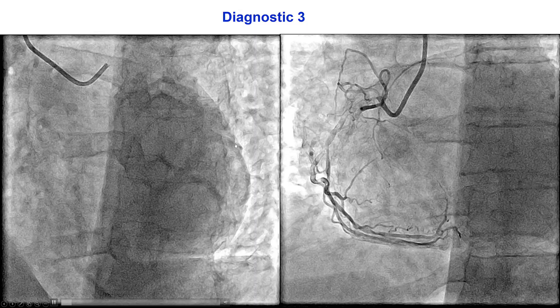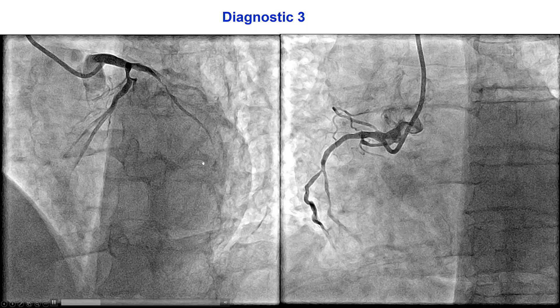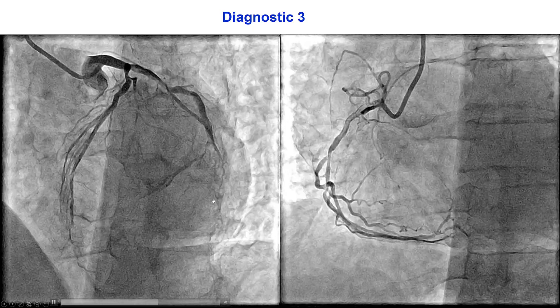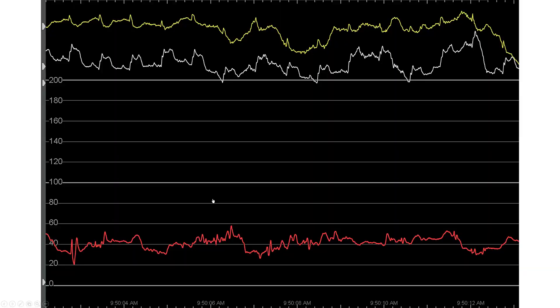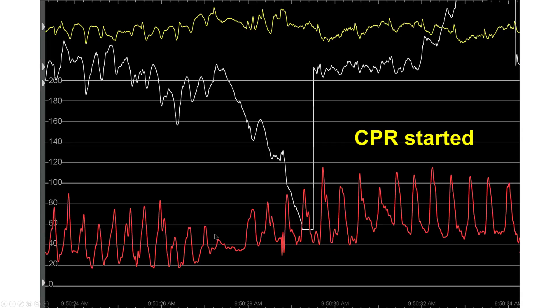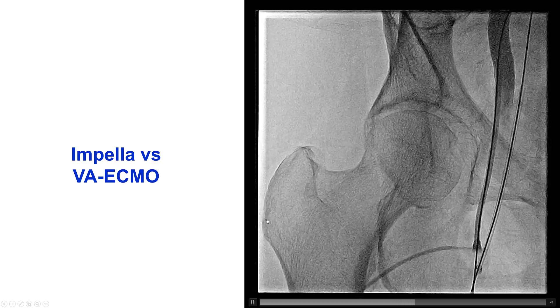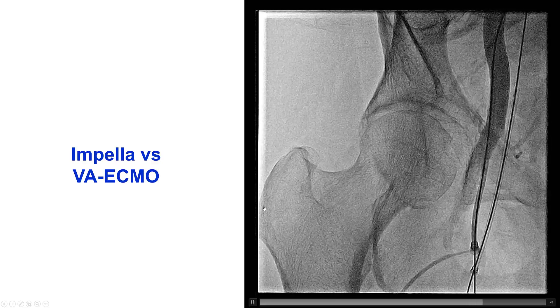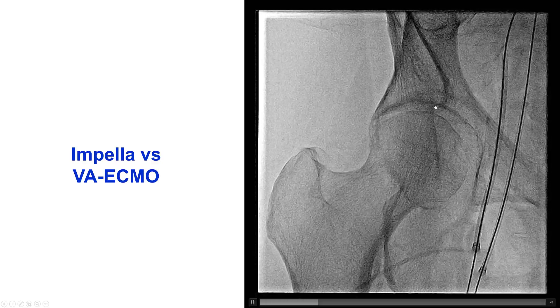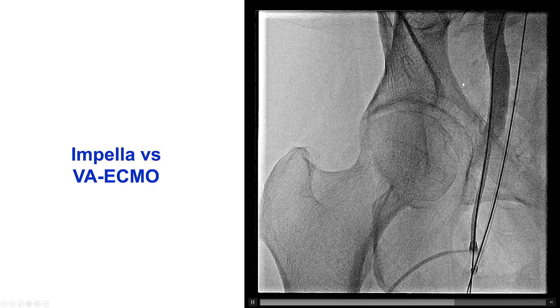The culprit seemed to be the circumflex thrombotic occlusion and the second obtuse marginal thrombotic occlusion. However, during the angiogram, the patient started getting more hypotensive, and then he actually had cardiac arrest. He had cardiac compressions, a code was called, and the patient was emergently intubated, and then we gave him a lot of epinephrine.